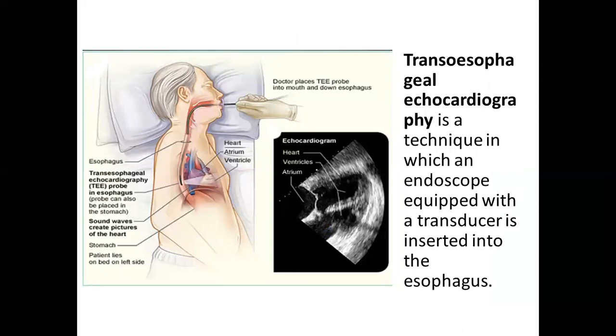Other technique, which is performed relatively rarely in cardiography, is transesophageal echocardiography. Well, sometimes it is a necessary technique, especially if we want to understand how the atrium, and especially the left atrium, looks in patients who are unable to perform transthoracic echocardiography.